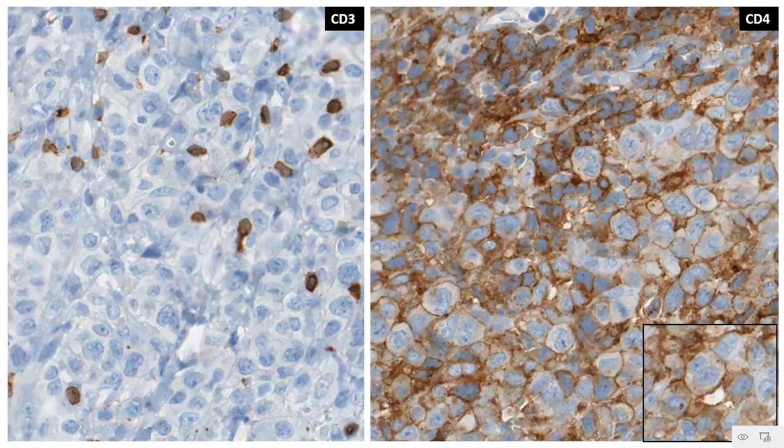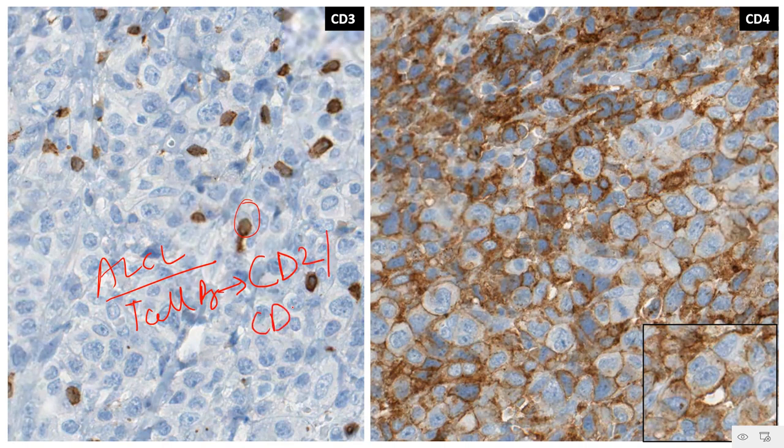So if you do IHC, you see that the T cell marker CD3 is only expressed in a few of the background small lymphoid cells. The bulk of the atypical large cells are actually negative for CD3. Now keep this in mind in the context of anaplastic large cell lymphoma. As I have said already, many of these ALCLs will basically drop multiple mature T cell markers. What are the multiple mature T cell markers that we utilize in diagnostic surgical pathology? CD2, CD3, CD5, and CD7.